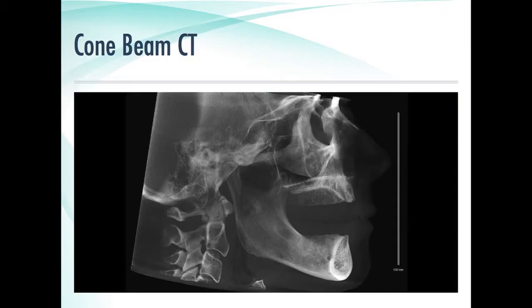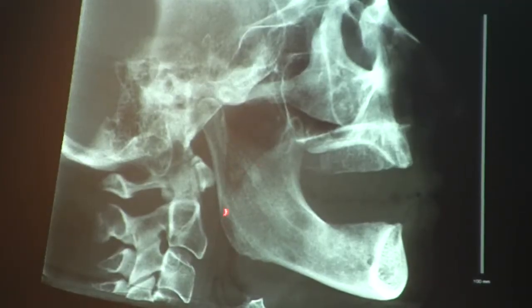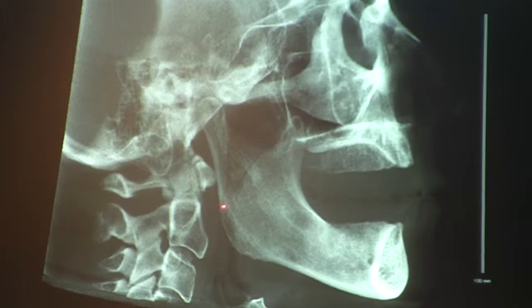We can slide this little gyroscopic thing up and down the airway to find out where the minimal airway space is. You can see this is a traditional cephalometric x-ray, which a lot of orthodontists would have, and they don't pick this up at all, which amazes me, but that's the airway right there. So that's the ones being passed around. It's this lady right here.